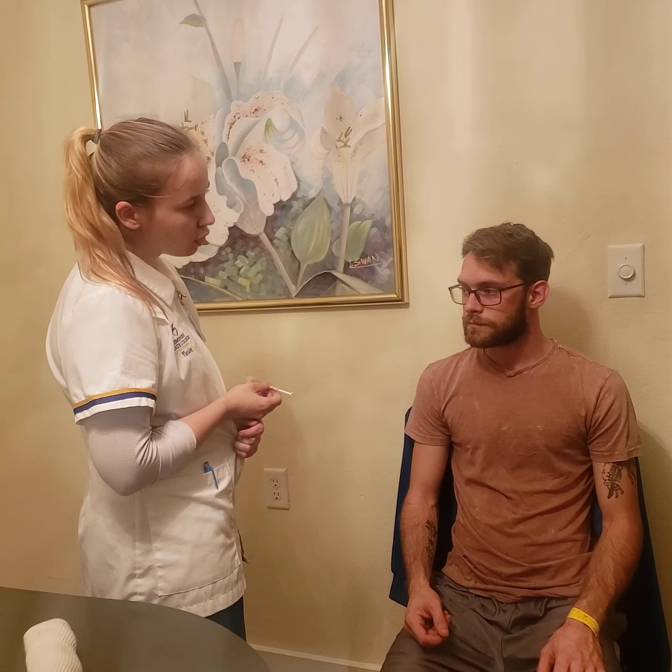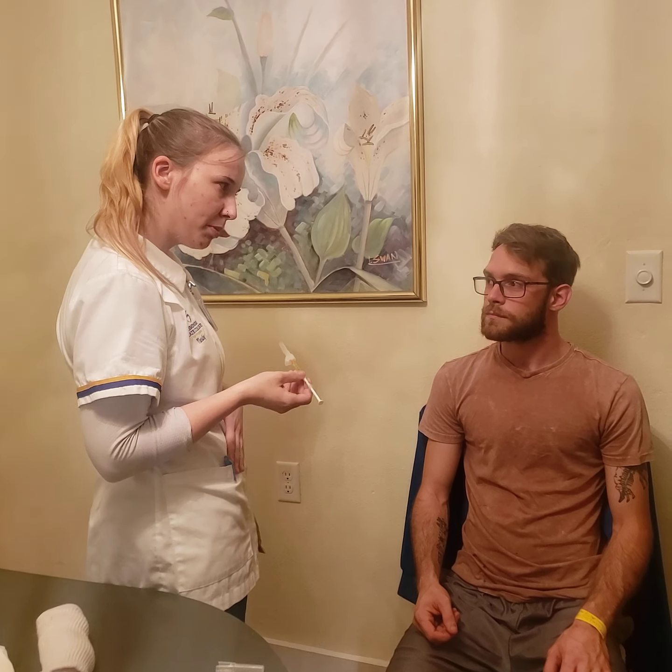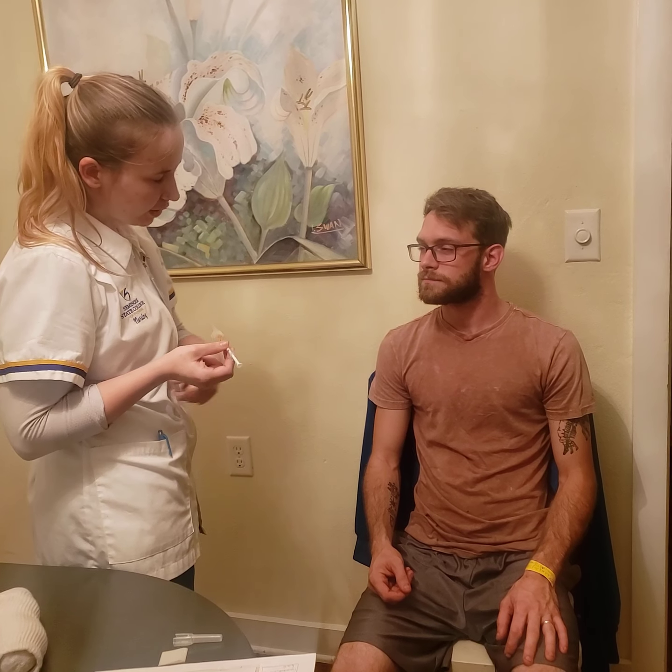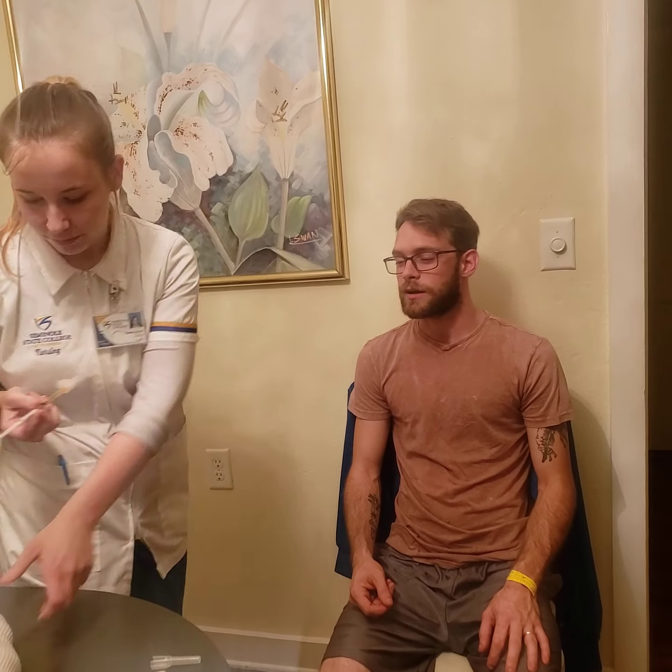Okay, so where did they give this to you last month? Where do you normally receive this injection? Do you receive it in your abdomen? Yes. All right, that's what I have charted here. Which side did they do last month? The right. The right side, so you want it in the left side this month? Yeah. Yeah, okay.